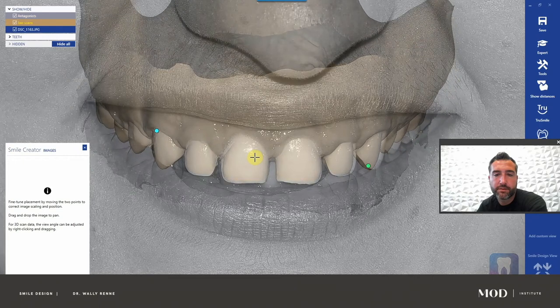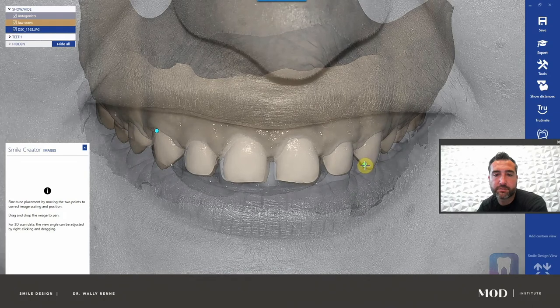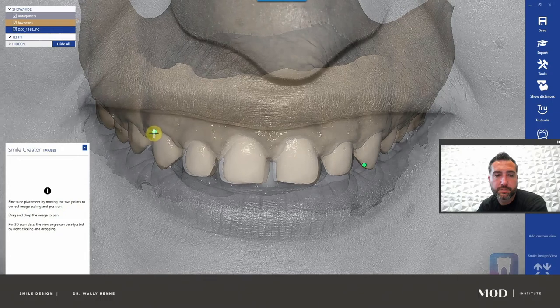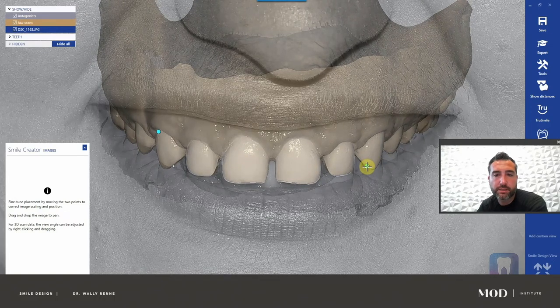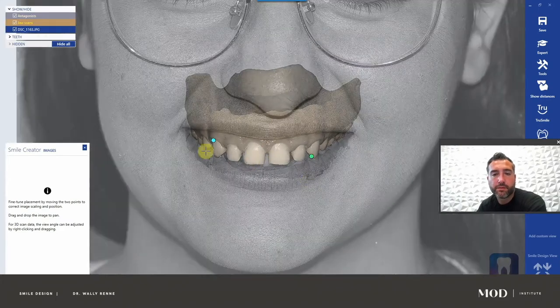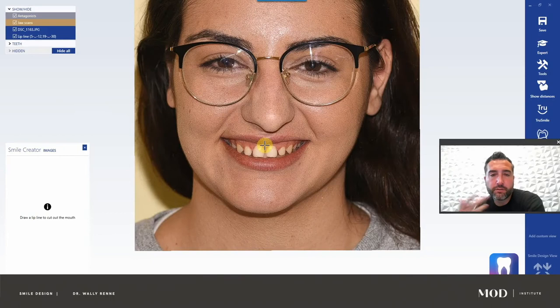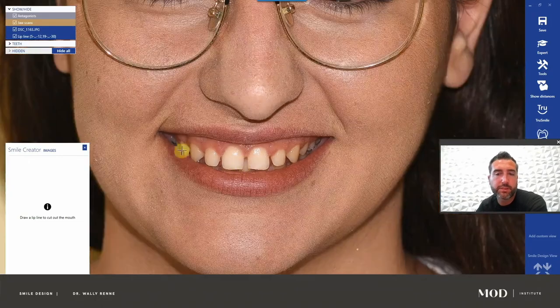When you have one photo, we got lucky here because the patient has a gummy smile and we have everything we need. It's much more accurate when you have one photo if you've screwed up your photography like in this case. So now we come in here and get these as close as possible. This is also teaching you how to delete and edit images if you accidentally load the wrong ones.